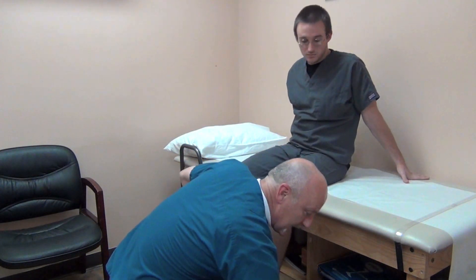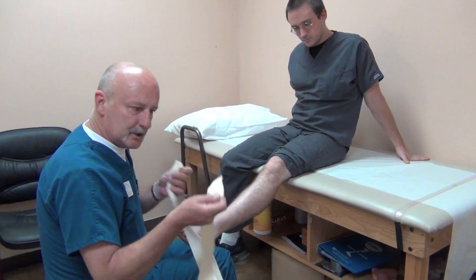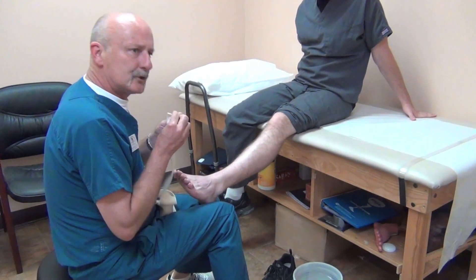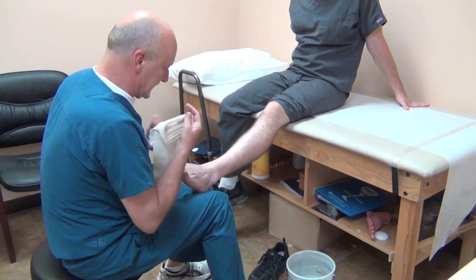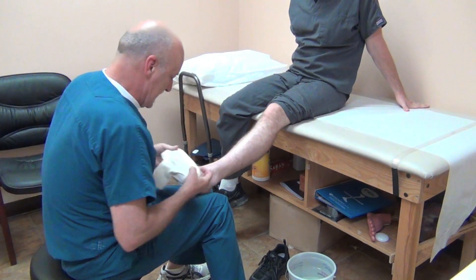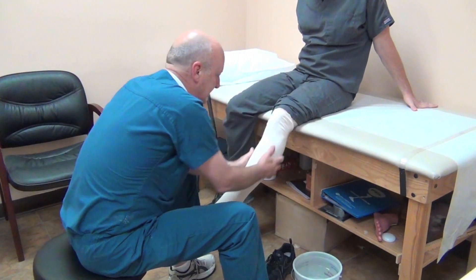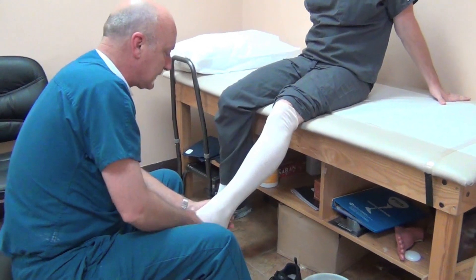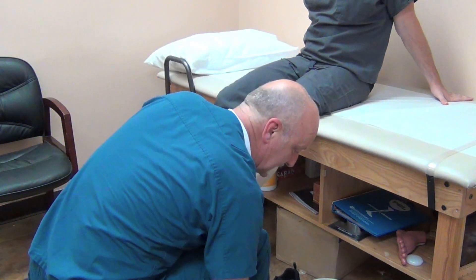Typically what I use for a stockinette is a good stockinette — I don't use the real cheap thin stuff. Two and a half inch stockinette works for 95% of the adult population. I like to have a good snug stockinette. Three inch tends to wrinkle too much. This molds really nicely to the foot.